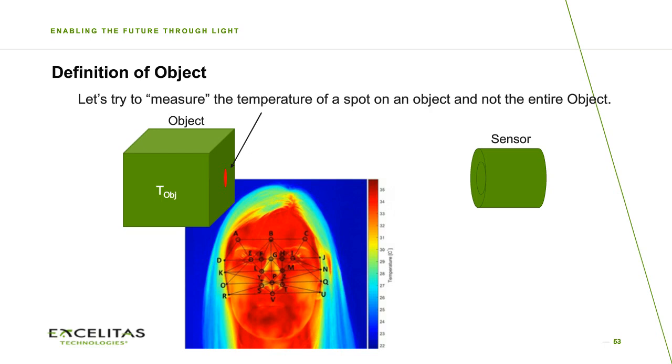Because, as I said, the skin temperature is still not the body core temperature. What you will see at the skin, let's say it's 34 degrees C, you then need to correct for this difference of 2.5 degrees or more or less with the body core temperature. So the question was, can you measure it from the top?